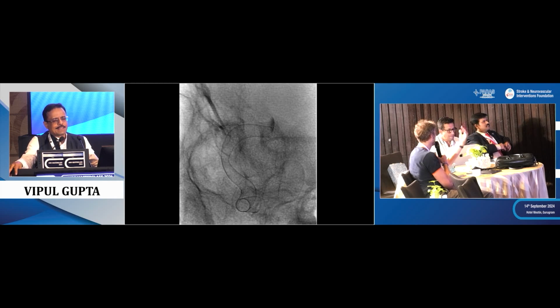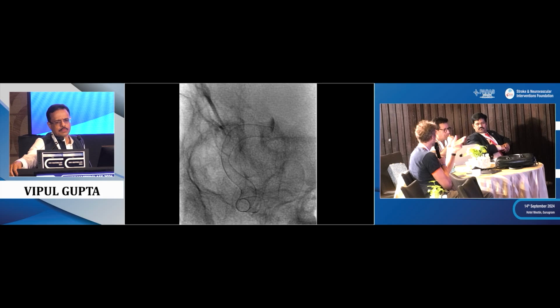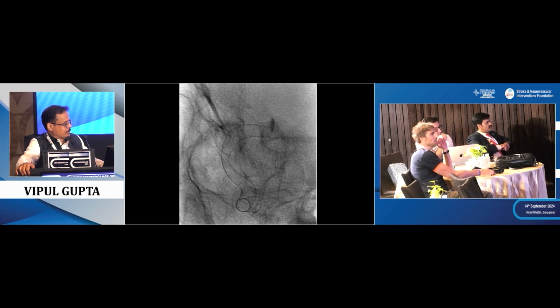Okay, this is the mechanical one, and there is, I would say, the biologic fish mouthing. This may come in a delayed fashion, where the healing process of the tissue is applying forces to the stent, and the stent will change in shape because of this healing traction that will occur on the stent, especially in young people, especially the women. So it's a different type of deformation of the stent: acute for mechanical reasons, immediate, and in the second way because of the healing process.